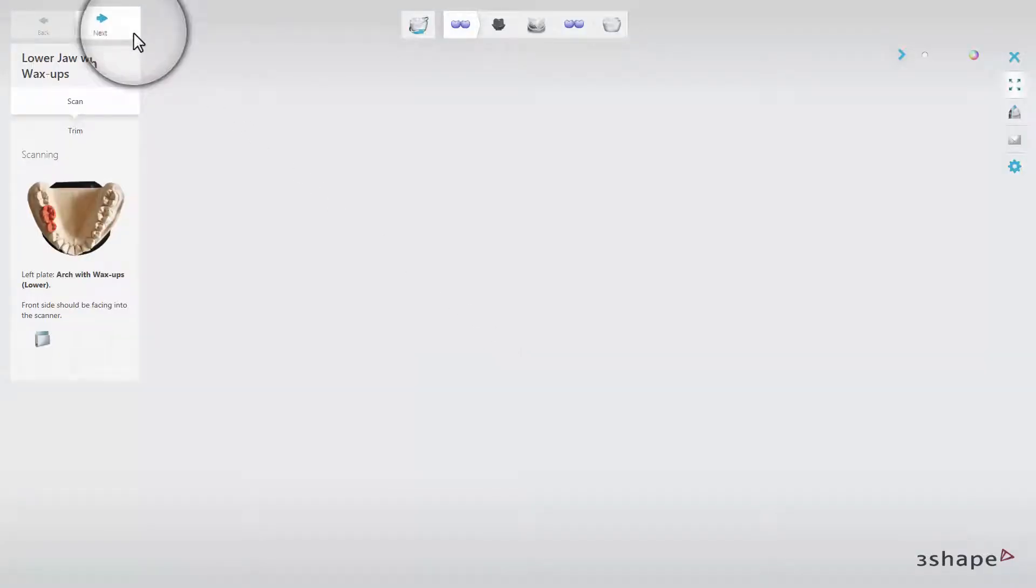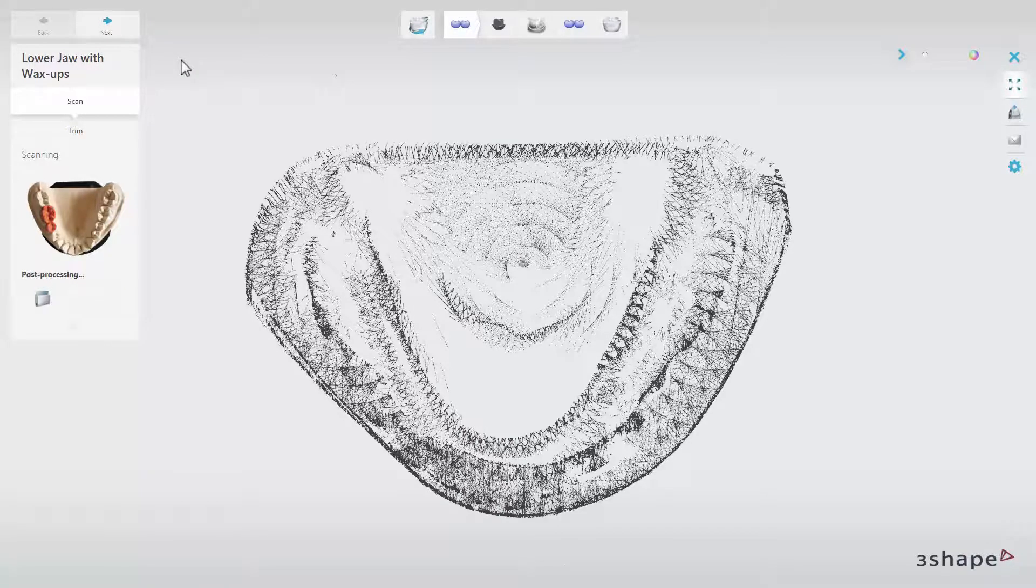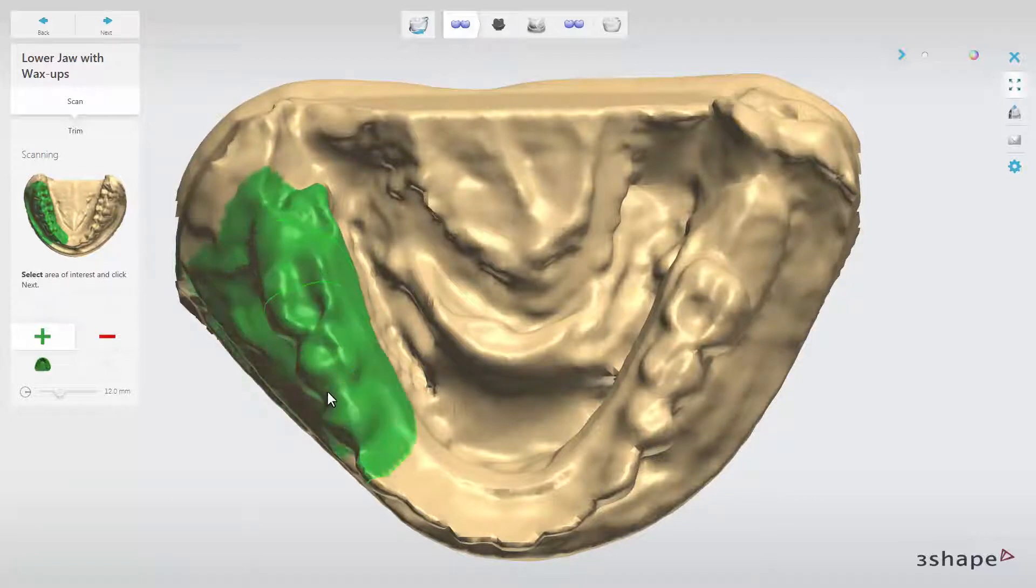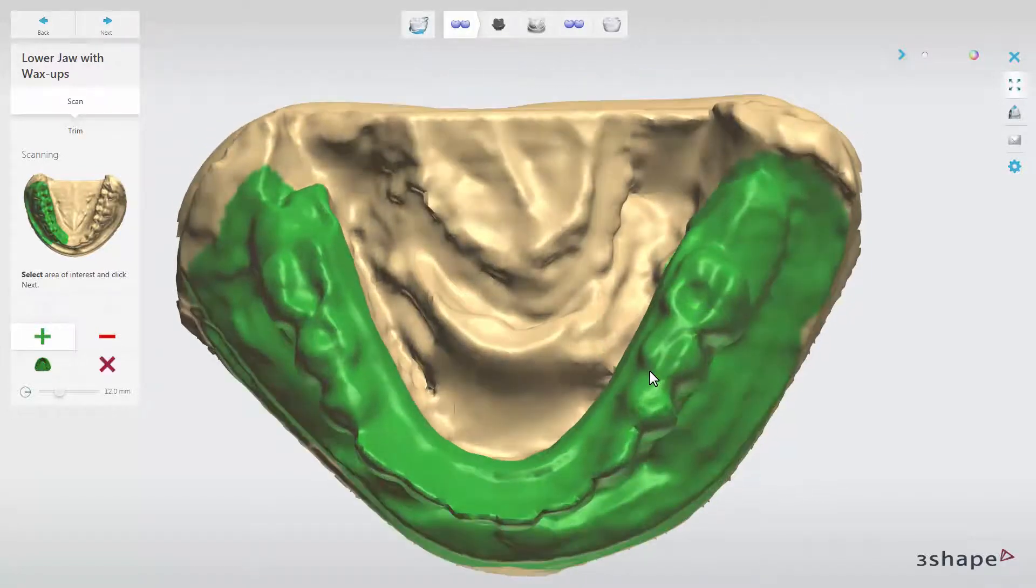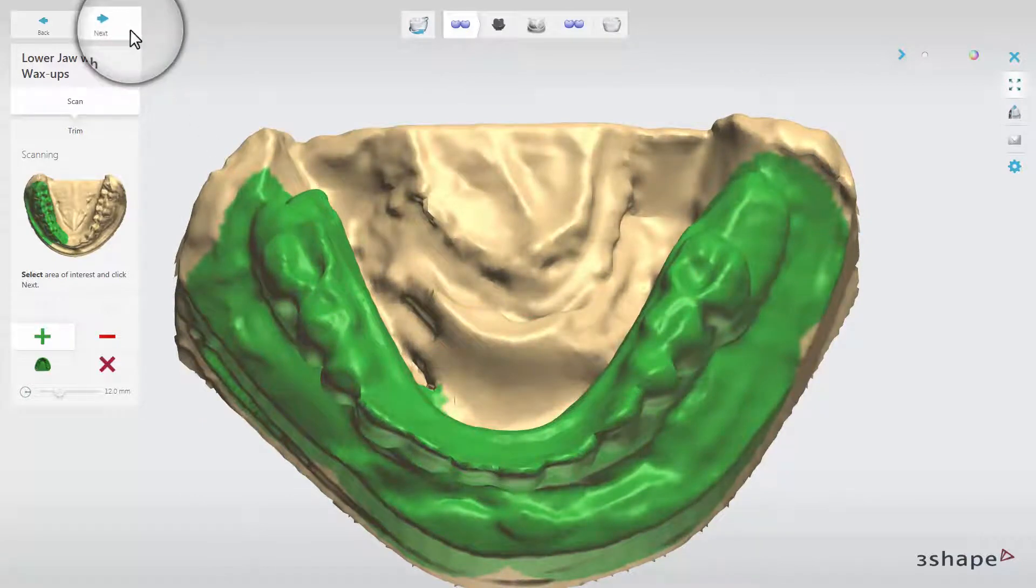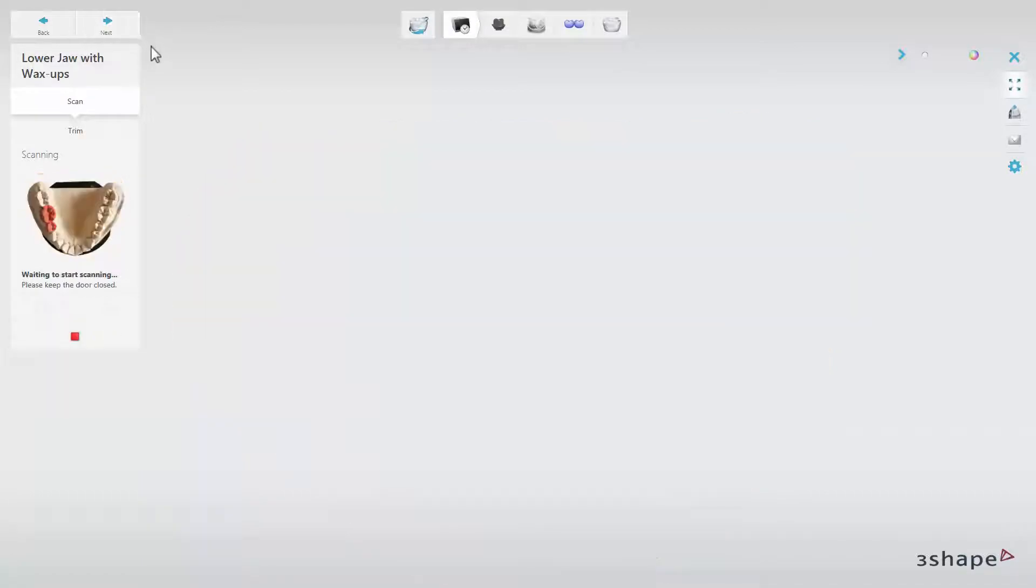Click Next to start scanning. Select the area of interest, choose either a whole model or mark only an arch, and after doing that, click Next. The scanning process will start.